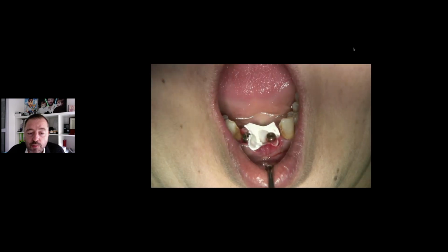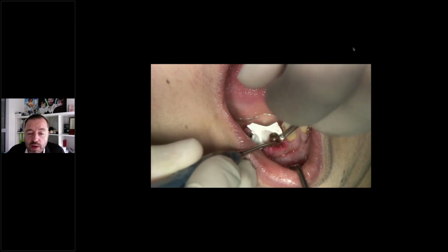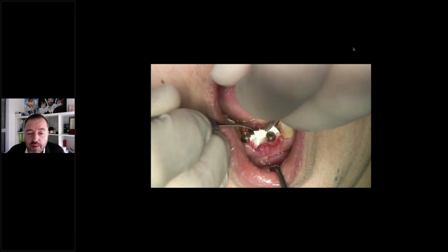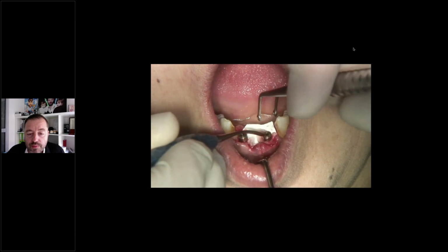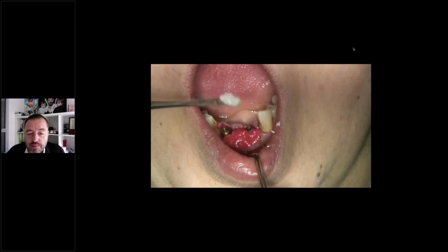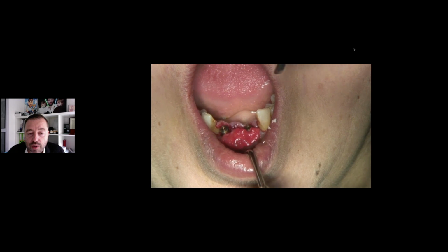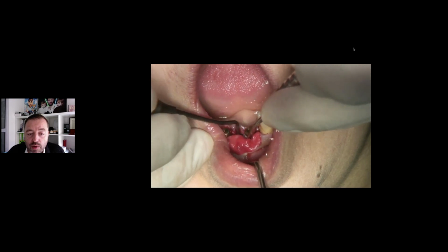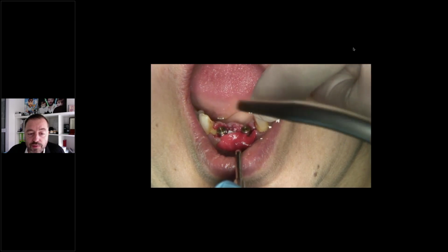Again, the open healing concept. So basically, we fill the gap with BIOS, and then we use the collagen membrane, the BioGuide, to protect in an open healing manner the gap between the implants where we had to fill with biomaterial. We prepared the membrane before, then we fill the gap, and the tissue level implants will basically integrate the bone, and we will never re-enter at the level of the bone.